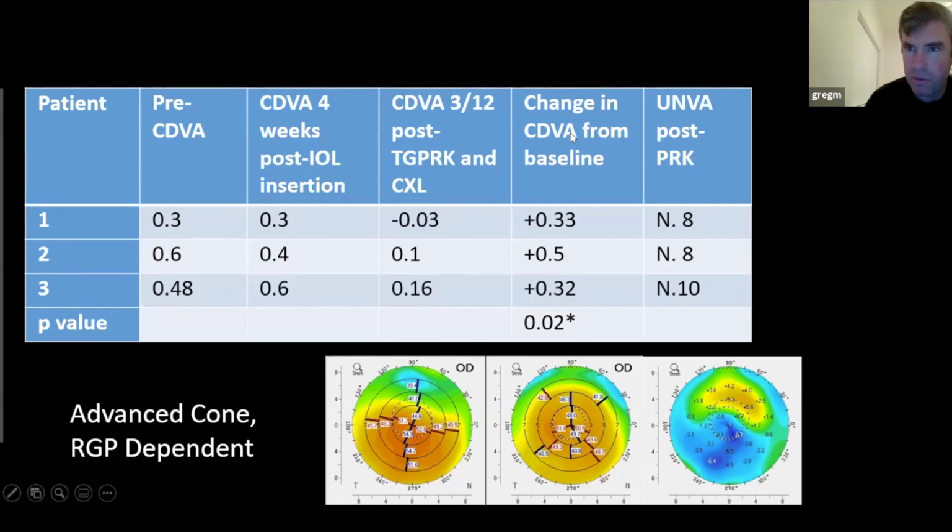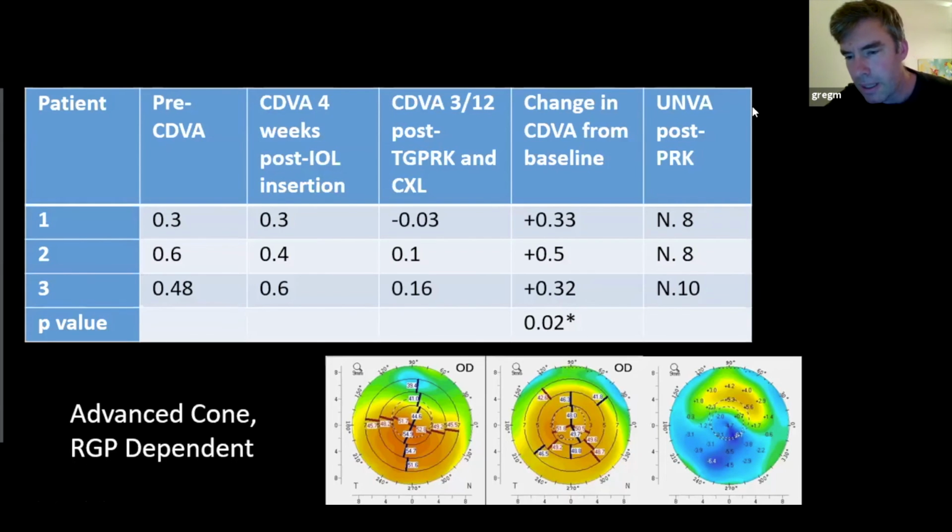It can be a powerful tool for regularizing a corneal shape, particularly coma. It's really good at elevating Ks in one half of the cornea and flattening Ks in the other. And you can see in that difference map in the bottom right that's a fairly classic topography guided PRK difference map.